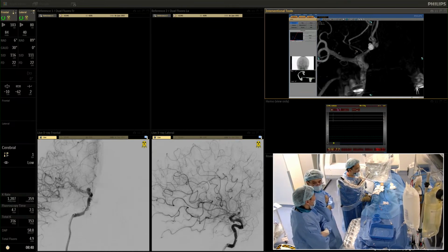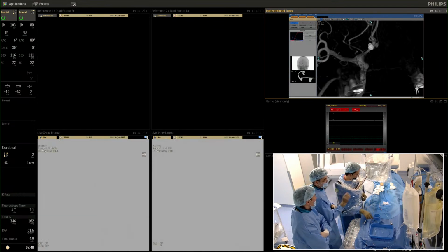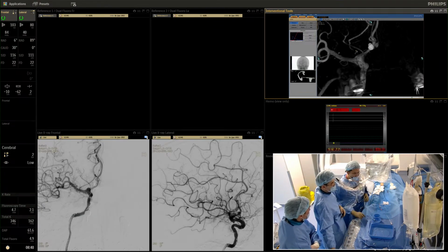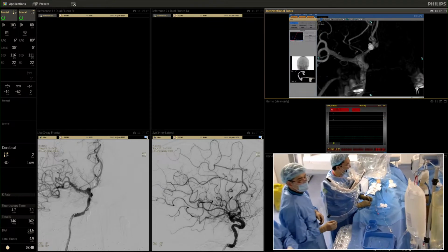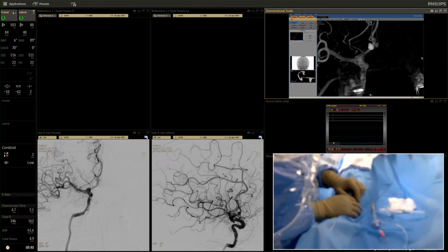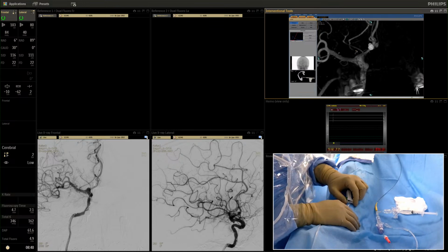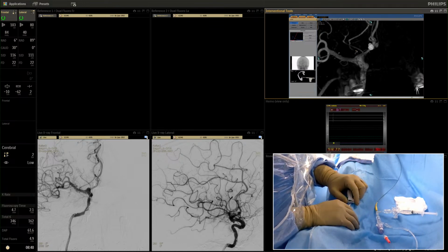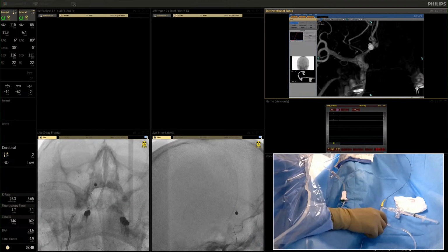Anchoring. It's okay, it's a cardiology technique. I will open the flashing. And now there is no aneurysm. No aneurysm, yes, because of the spasm. We will flash some nimodipine and then it will be clear. Yes, the aneurysm will appear.